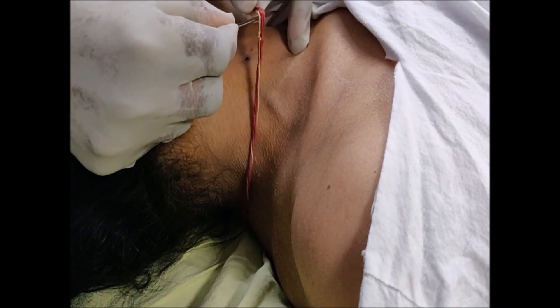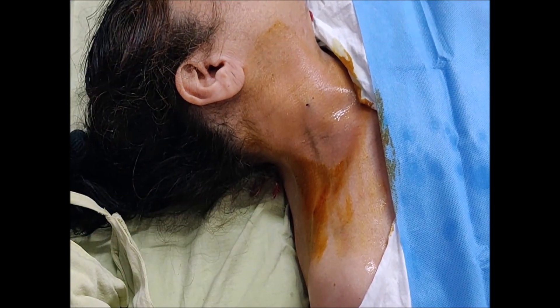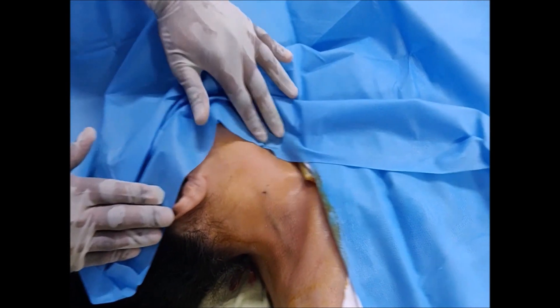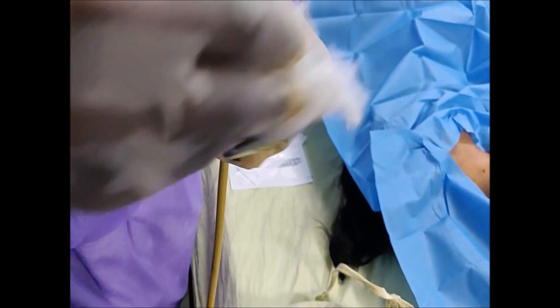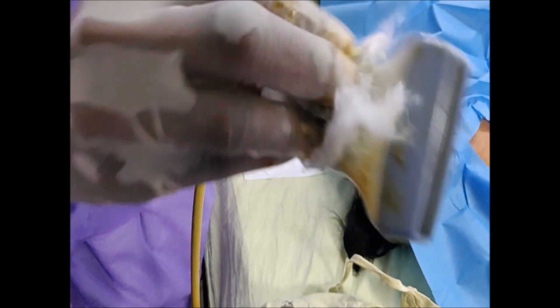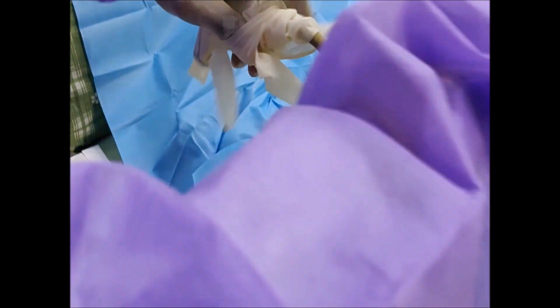Carefully remove all possible things that can contaminate the site of insertion. Prepare the area by scrubbing with chlorhexidine or povidone iodine for a minimum of 60 seconds. Drape the area carefully and make sure to include all the important landmarks within the sterile field. Prepare the linear probe with povidone iodine followed by sterillium; chlorhexidine can also be used if available. Wrap the linear probe in a sterile sleeve, being careful not to contaminate it.